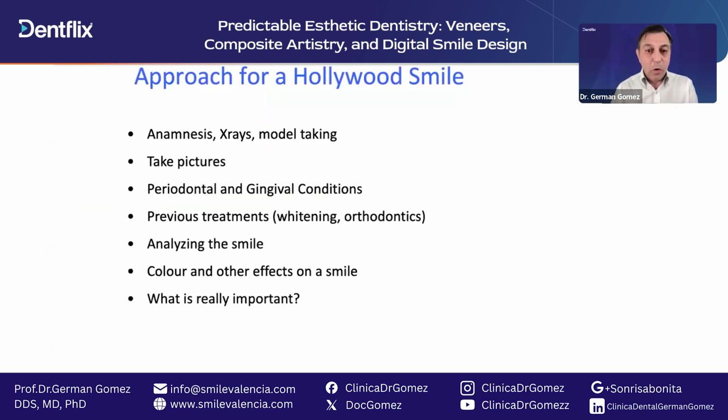In order to make a smile design, digital or not, the digital smile design only does now everything that we have made beforehand with our hands. We do it now digitally, 3D CAD/CAM. Usually it's done by our dental technician, but not like that.